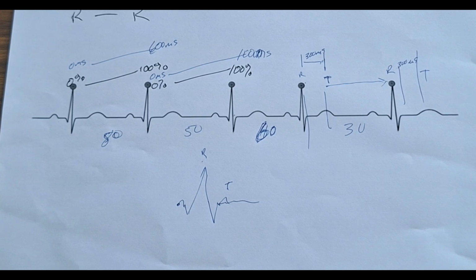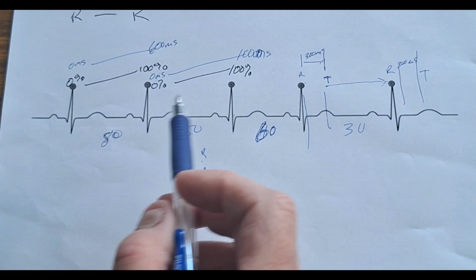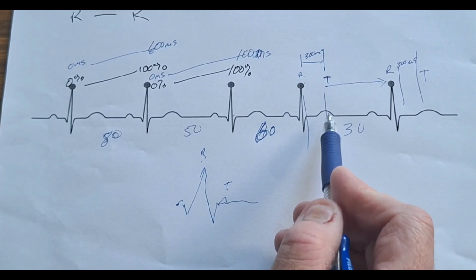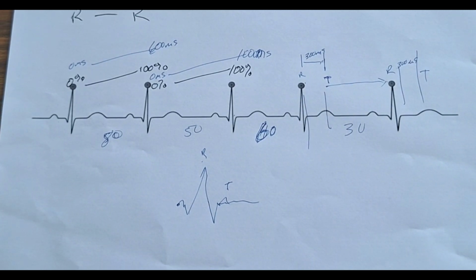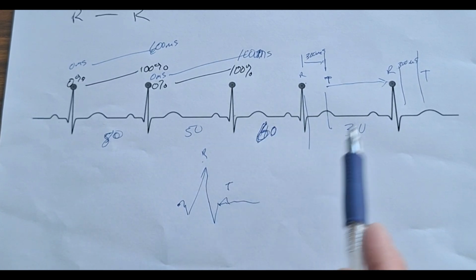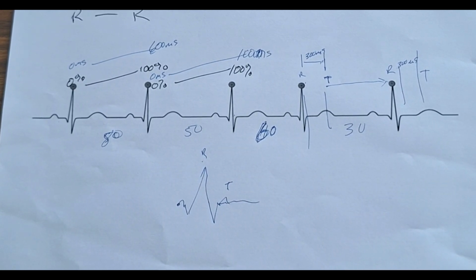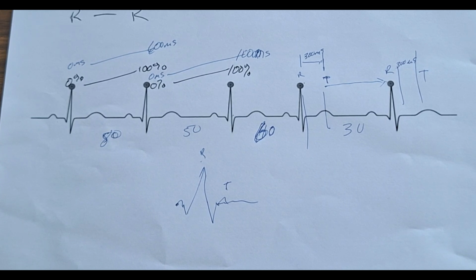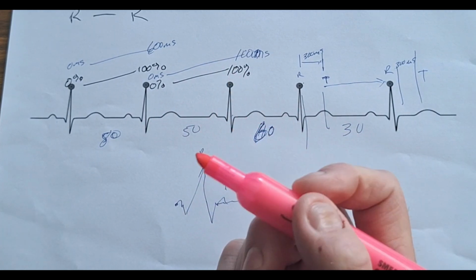So just know for this video that from your R to the T wave, it is relatively stationary in time from beat to beat to beat. And this matters when we're setting up our physics for our scanning, especially for not only CTA scanning, but also for structural anatomy as well. Because for certain structures, we need to be in certain different phases of the cardiac cycle.